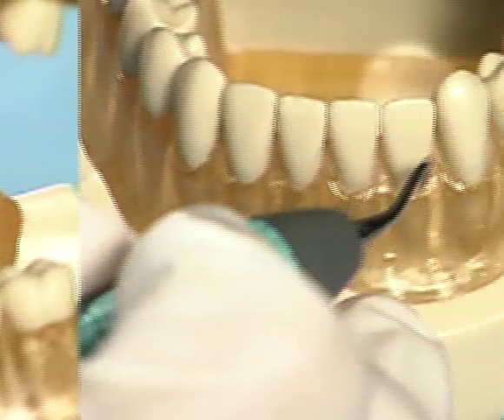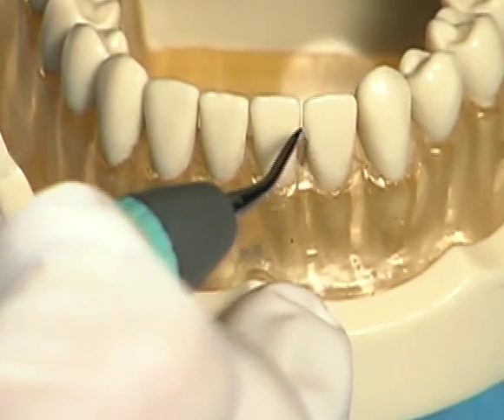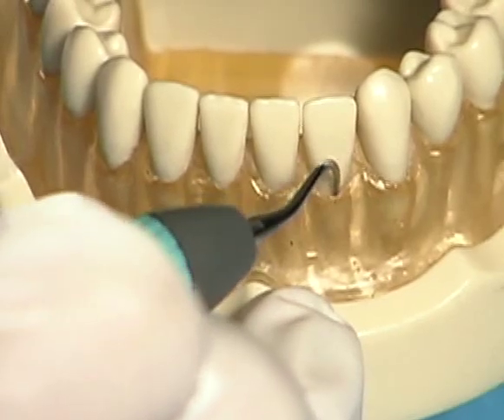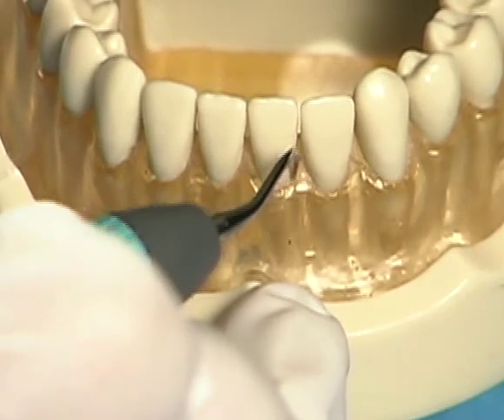Left and right curved thin tips can also be used to instrument anterior sections, especially when teeth are crowded or buccally or lingually inclined. The long thin tip allows access and adaptation in areas that may otherwise be difficult to reach.